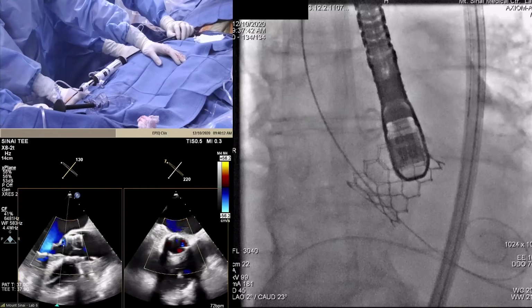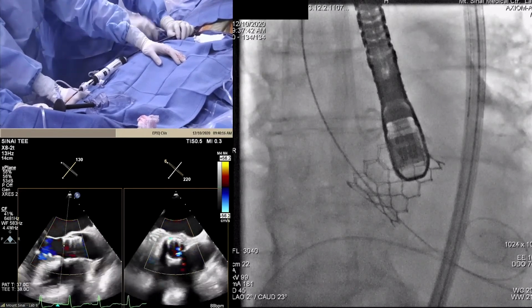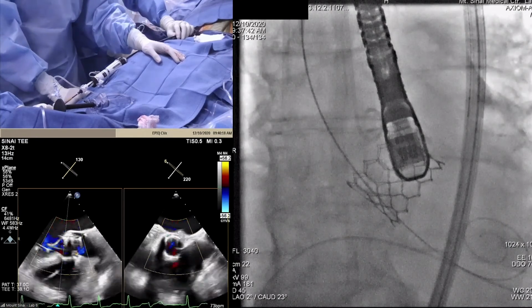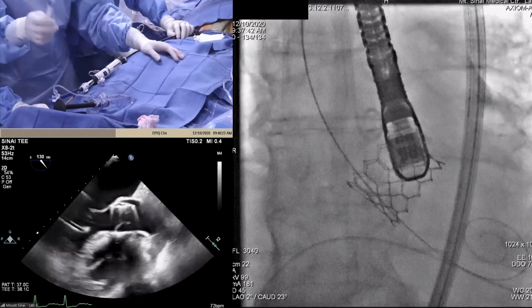See on the left screen? That's at least mild there. I would add the, at least mild paravalvular regurgitation. But let's ask the panel. We go with 2 more cc. Yeah, sure. What do you all think?